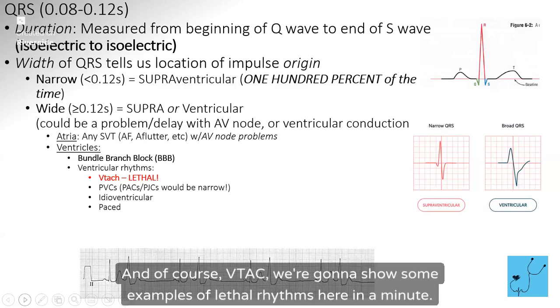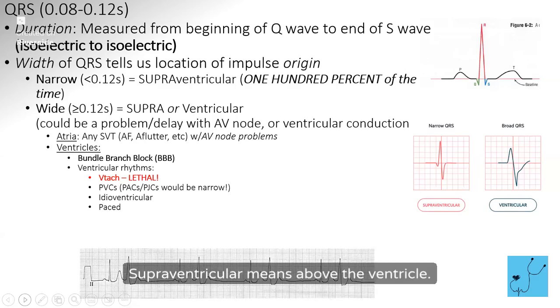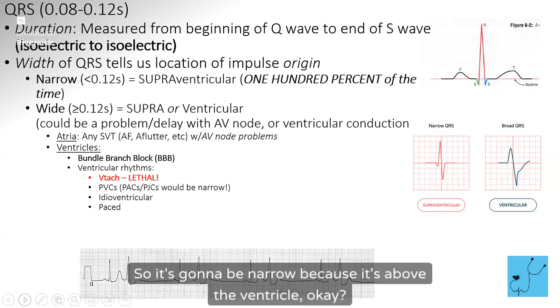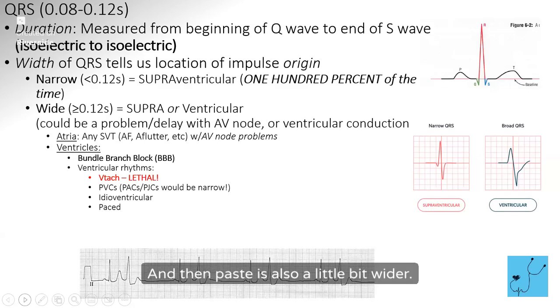And of course, VTach, we're going to show some examples of lethal rhythms here in a minute. A PVC, premature ventricular contraction, we would expect to be wide because it's in the name, it's ventricular. Supraventricular means above the ventricle. So it's going to be narrow because it's above the ventricle. Okay. And then idioventricular is really bad, and that's really just a few really wide, ugly beats. And then paced is also a little bit wider.